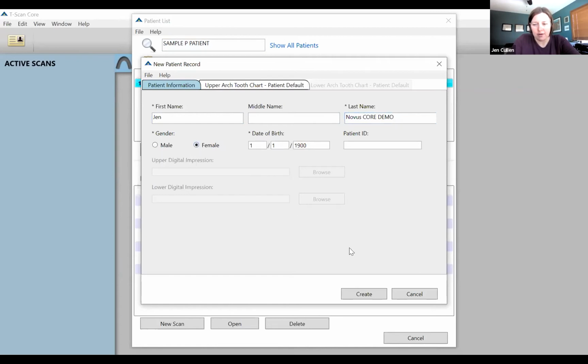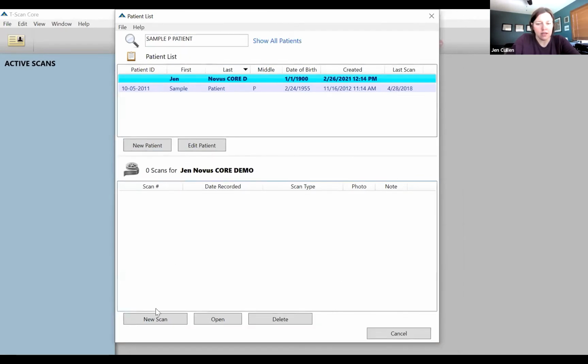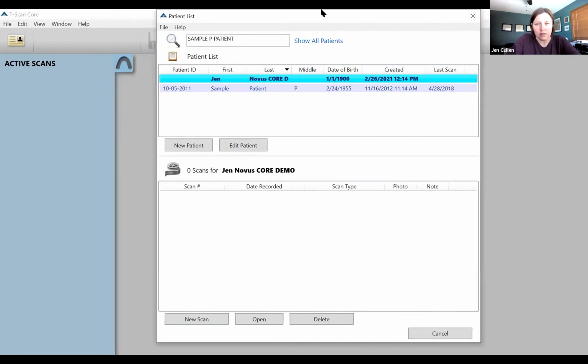I'm not going to put in my date of birth so you guys don't know how old I am. Okay. So now I'm going to do new scan. Sorry, my screen is a little off.